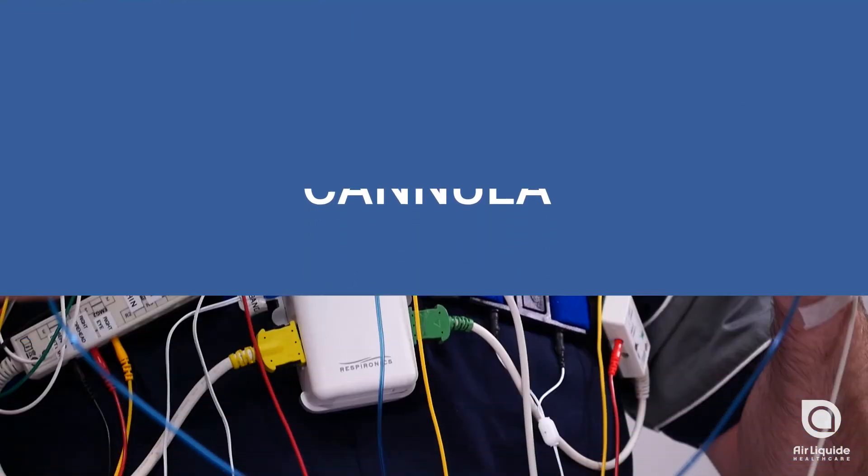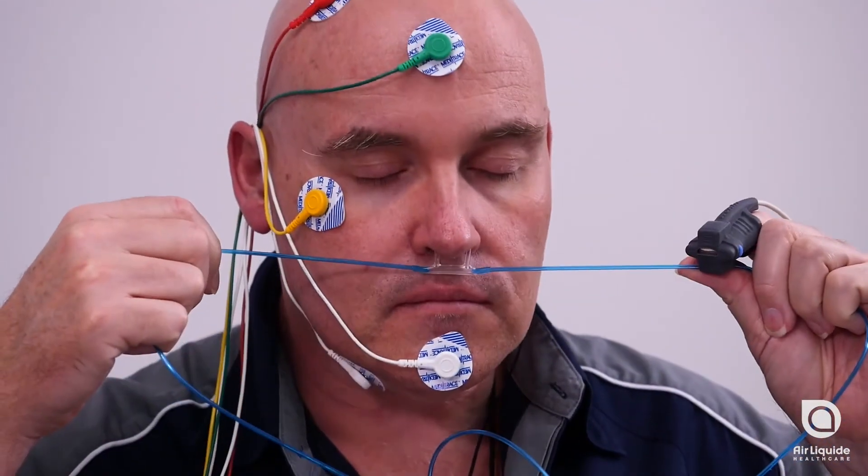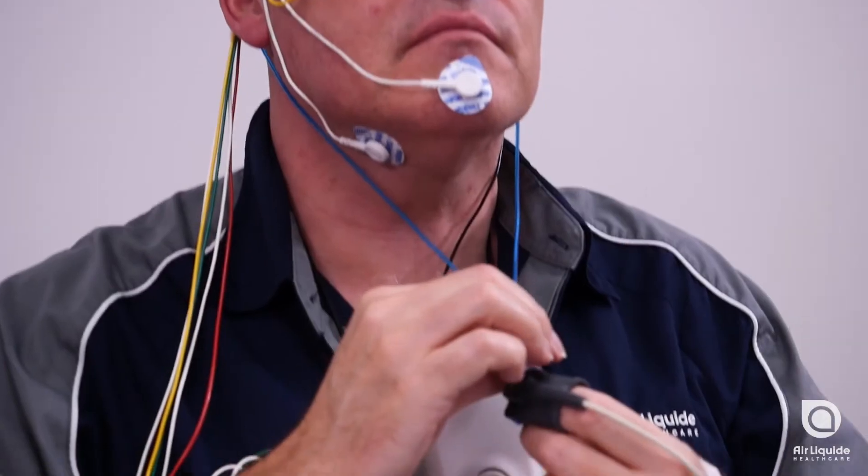With the curve of the nasal prongs facing towards you, position the prongs into your nostrils, ensuring the base of the cannula is firmly against the underside of your nose. Place the loops over each ear and slide the toggle up.